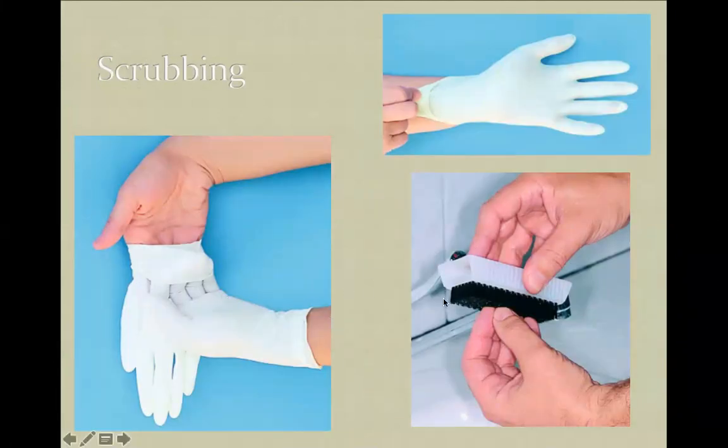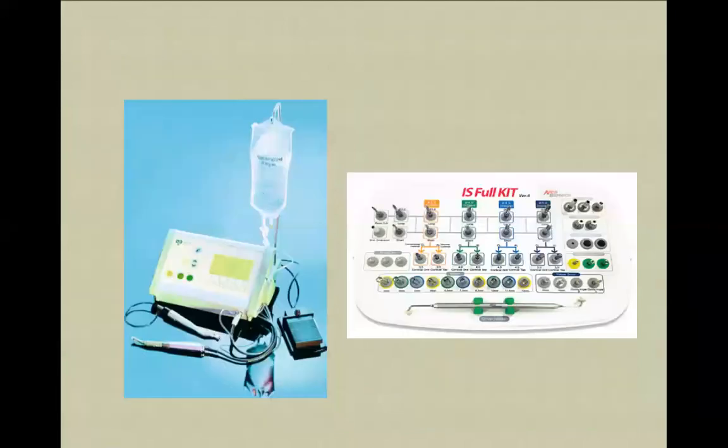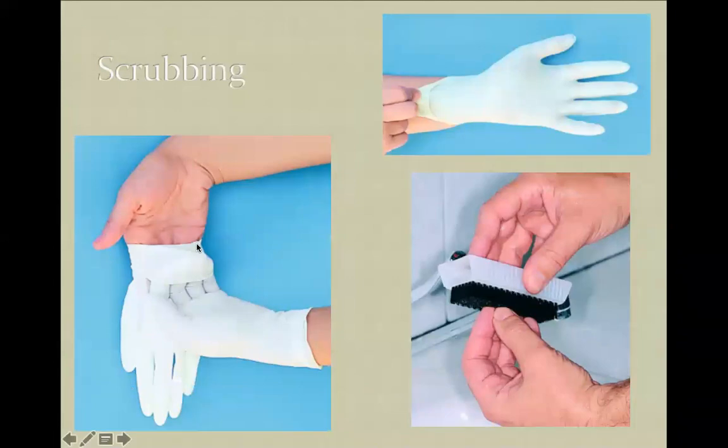You have to use scrubbing, and sometimes you have to be completely sterile. It depends on the number of the implants. Well, standard in our clinic, 1 or 2 is okay. You can use the gloves only. More than 3, okay, you have to be completely sterile. Your assistants should be completely sterile, because this is a procedure that requires total sterility.